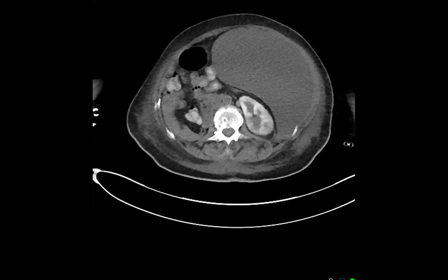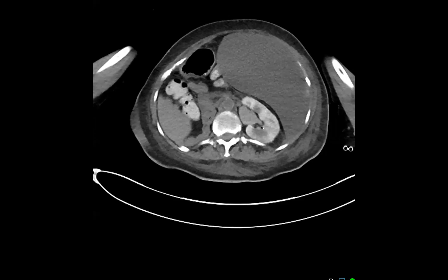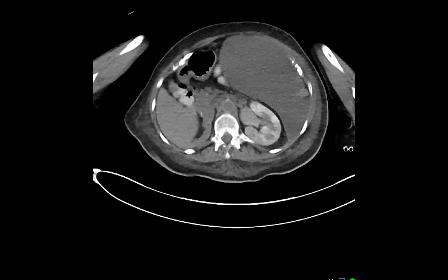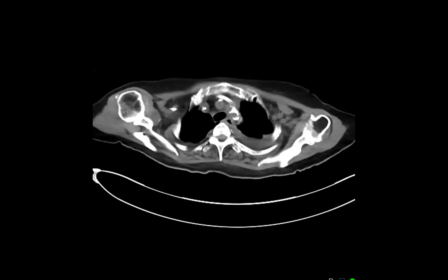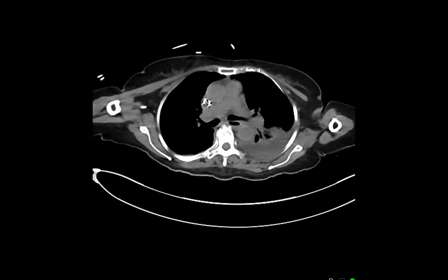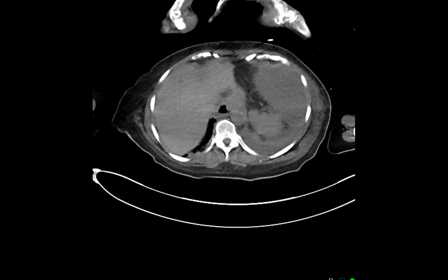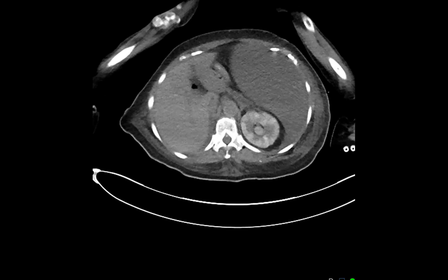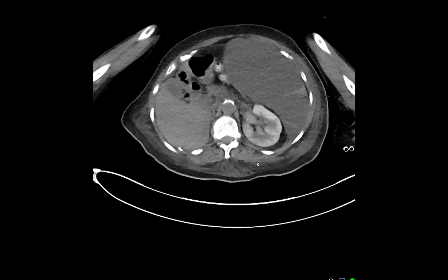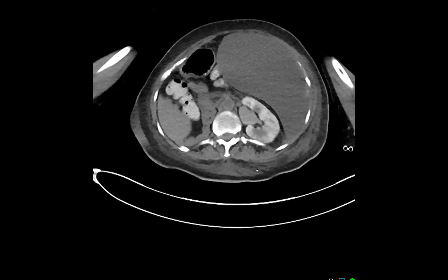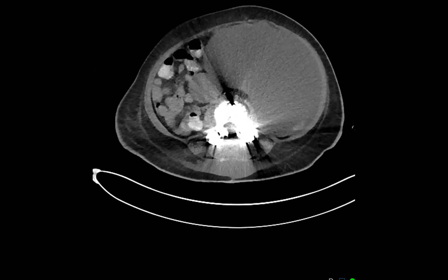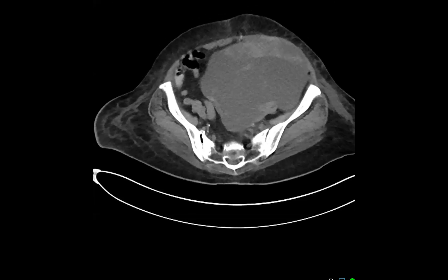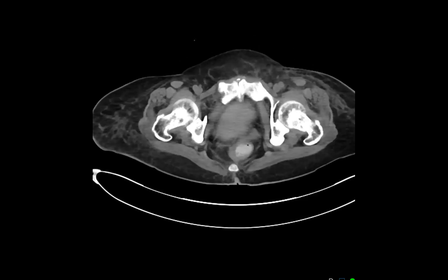For the first case, I have a 76-year-old female who complains of abdominal pain. Here we have the findings — this is non-contrast, by the way. There are many findings, but the most prominent finding — what do you think might be the source or cause of this lesion?